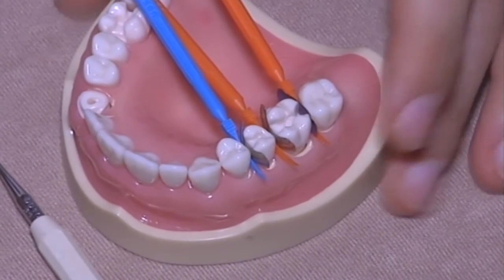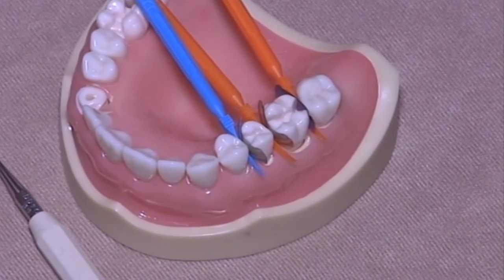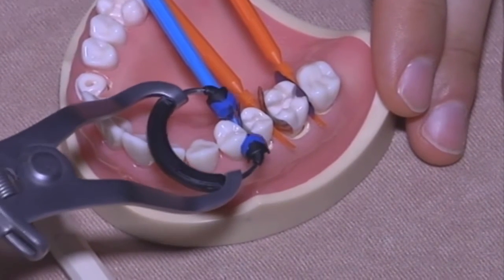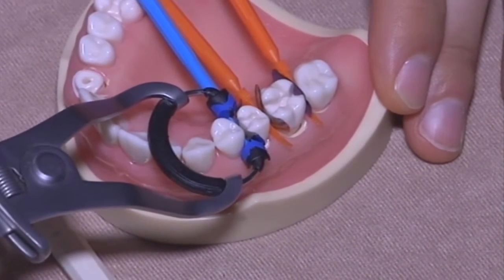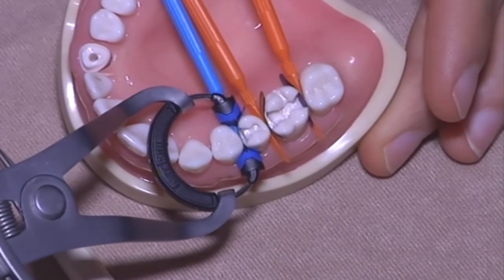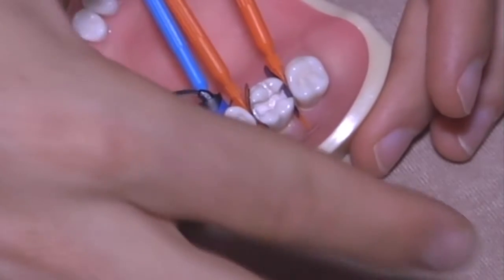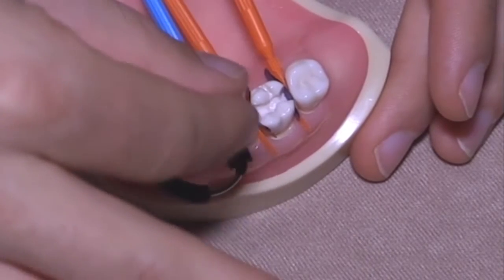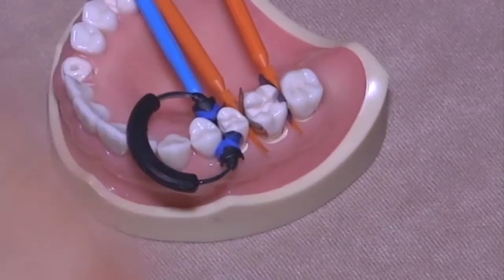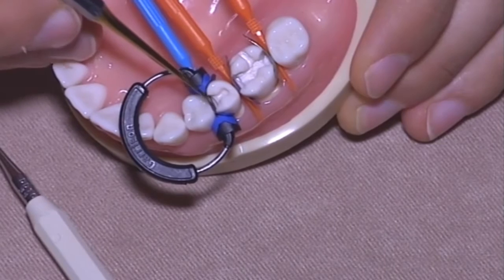Once you have that, you can place the ring. The ring must be placed opening it as much as you can and then closing slowly in order to avoid that the matrix is pushed in between the interproximal area. If you do it immediately, the matrix is closed in between and you can have a problem here.